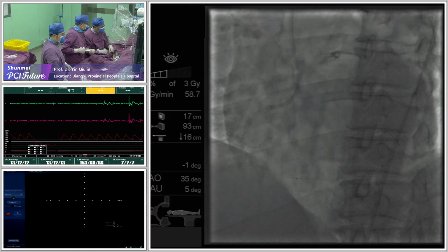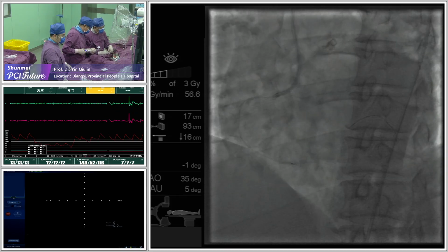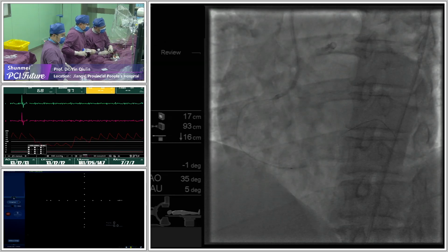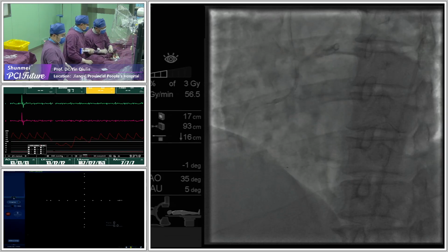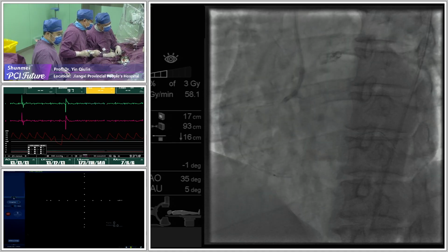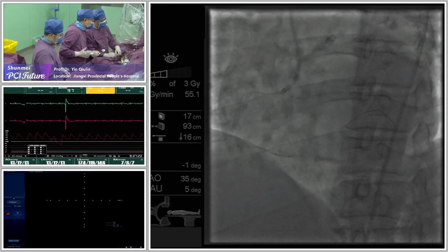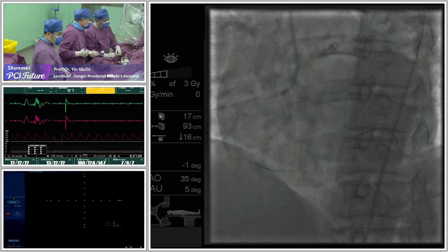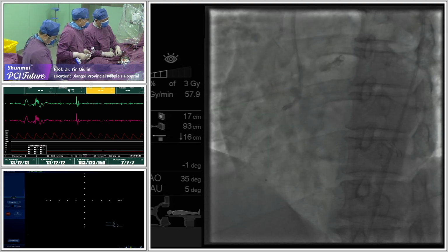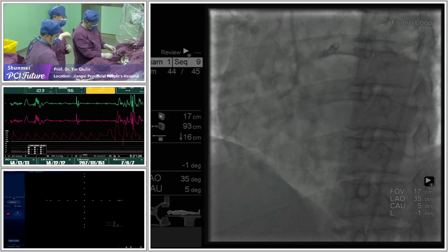If your microcatheter is not following the wire, most of the time it's because you are outside the strut. Sorry, so the pressure wire, I think, went out at the beginning, went in, and then it was very good because the track of the wire was perfect. But the microcatheter is not following because of this track inside, outside the strut. So for sure, your proposal was very, very interesting, and I think I will do the same.